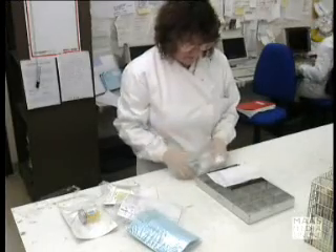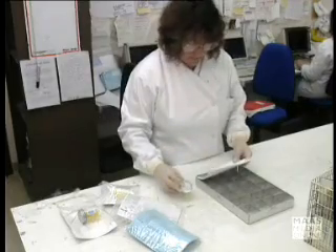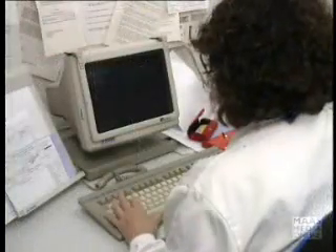When the specimens arrive at the laboratory, they are unpacked, labelled, and the details entered onto the computer.